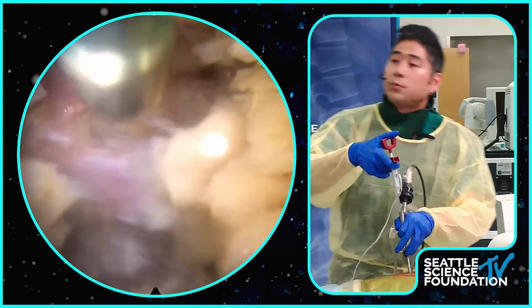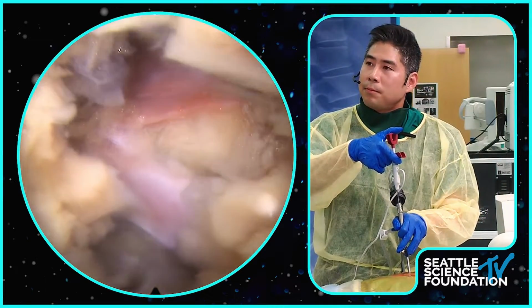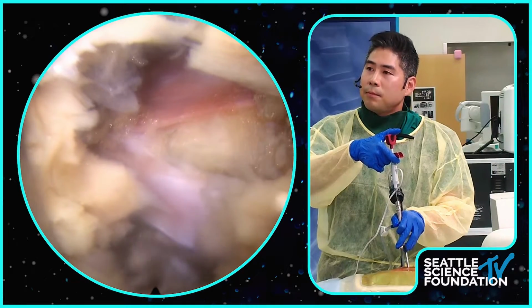Hey, John, just stay there for a second. If somebody, say your resident, is coming in transforaminally and you didn't notice, where would it show up?